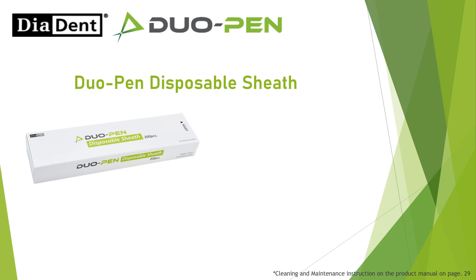Duo-Pen disposable sheath: One-time use — discard after use.